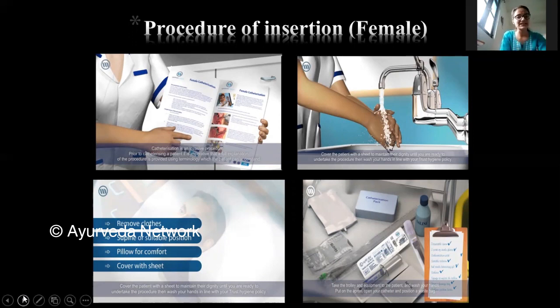Next, you are going to again clean your hands and remove the clothes of the patient, but remember, you should not entirely expose the patient. You should expose just the area which you require, and place the patient in the supine position. You should provide a pillow for comfort, cover her with appropriate sheets, and have a trolley prepared.